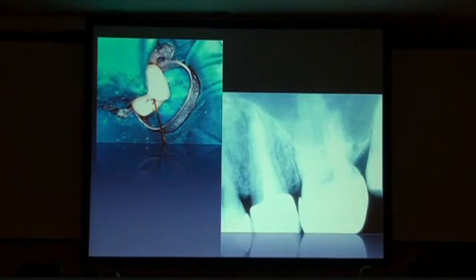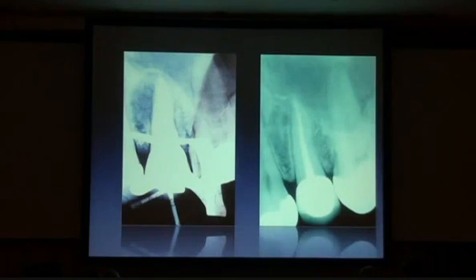Using, again, conventional treatment just to maintain this information to you, using the laser then in the root canal, and you see the situation before in this part, and just 6 months later, also in such a severe case where there was a fistula canal combined with a cystic formation in this area, we could gain with 3 laser treatments a very nice reconstruction of the tissue, periodontal ligament is repaired, and the reossification has taken place in a very nice way within just 6 months of time.